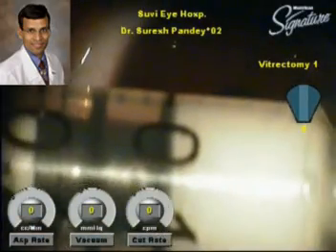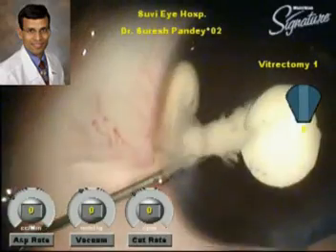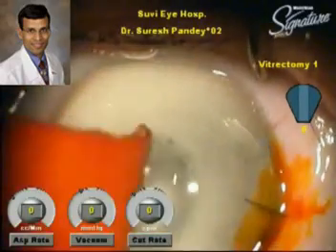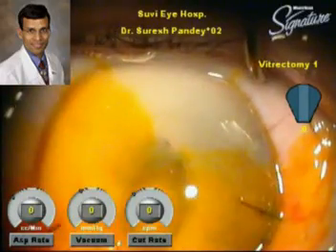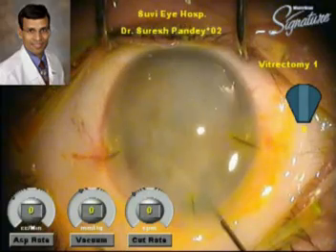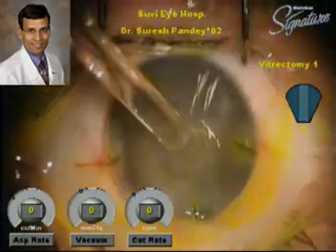This is another clip showing the injection of intracameral preservative-free triamcinolone into the anterior chamber. Fluorescein is used to see that the incisions are well sealed. The triamcinolone is then washed out, and any vitreous strands that may be present in the anterior chamber are clearly delineated with the triamcinolone.